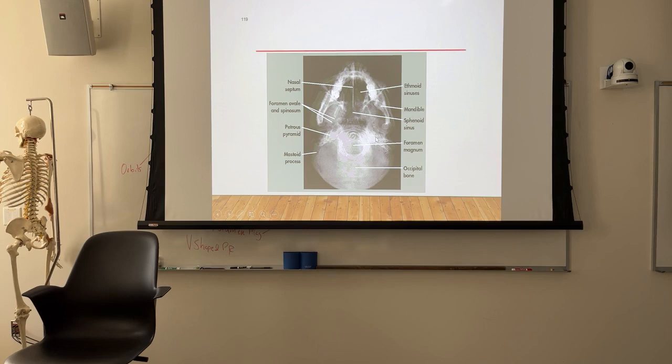That's an inverted V. It doesn't count, right? So foramen magnum, you see that as well, but in the Towne's, you're just not going to see the teeth projected out in front of the frontal bone. So the condylar process of the mandible, foramen magnum right in the middle, and it's really more rounded, and petrous ridges should be posterior to the condylar processes of the mandible.